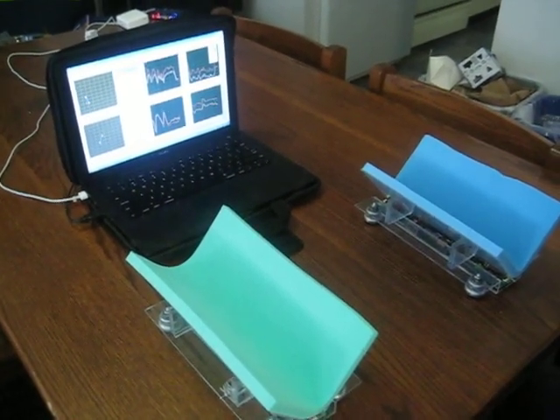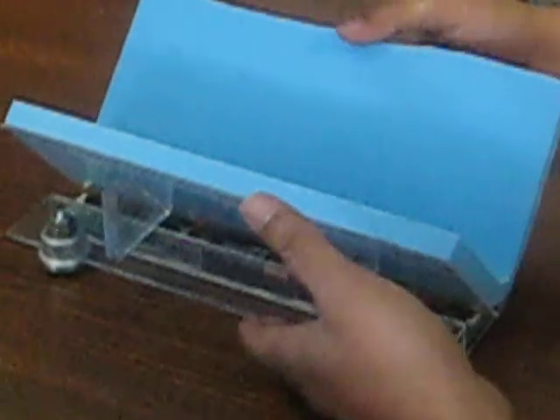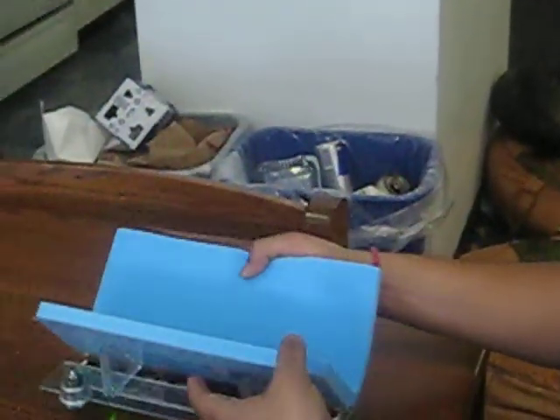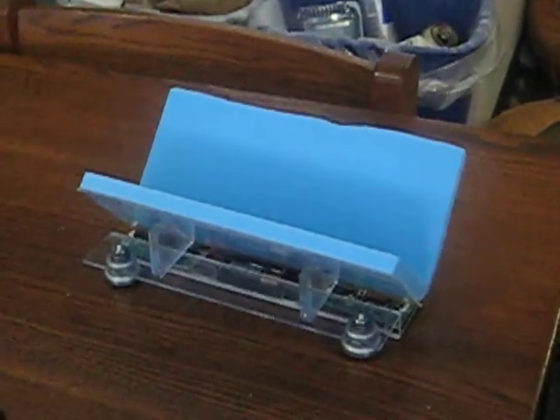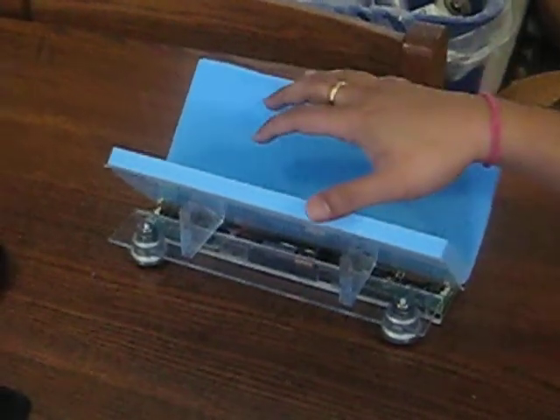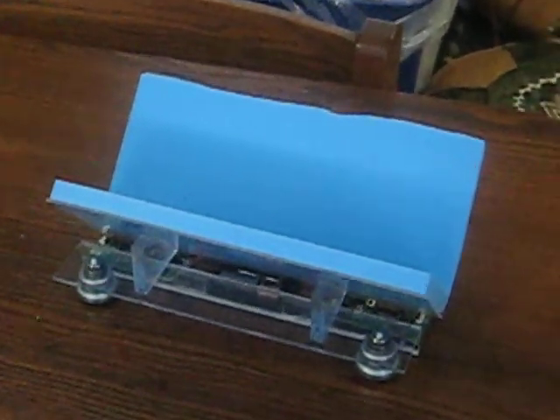So our device, shown over here, one for the left arm and one for the right arm, has two functions. The first is to provide a frictionless platform for these patients. As you can see, we have ball bearings, or rather ball transfers, on our device, 4 in particular. This allows for a free motion of the device, allowing their small movements to be translated into a motion in the 2D plane. And on top of that, we provide a qualitative analysis of the motion, basically a reconstruction on the computer that gets analyzed by our code.